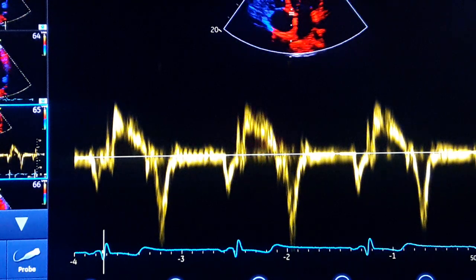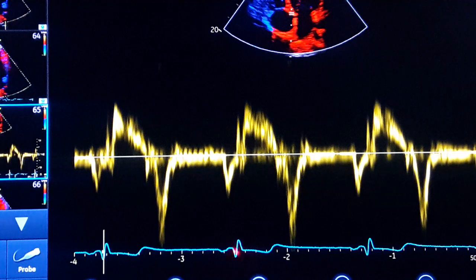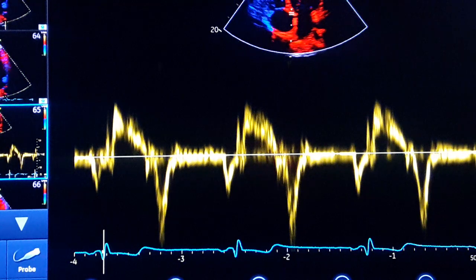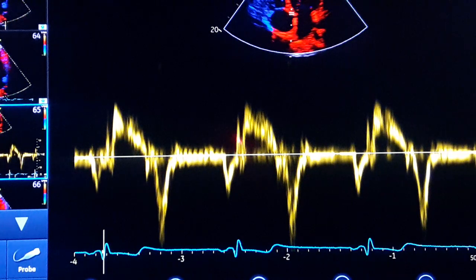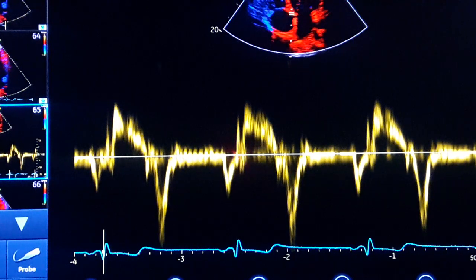This positive deflection represents systole, and you can see it corresponds with the EKG — here is the QRS complex exactly. This is the systolic phase, and from here to here is diastolic. These clicks represent the time of valve closure: closing of the aortic valve and the mitral valve.